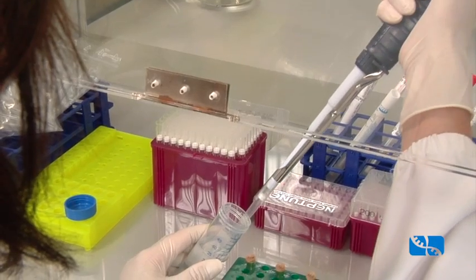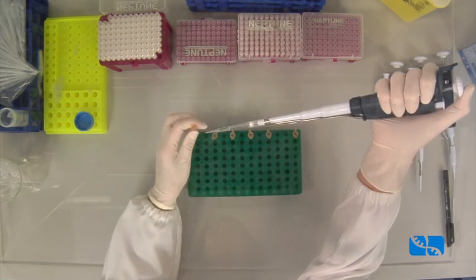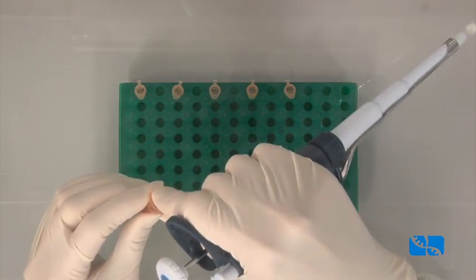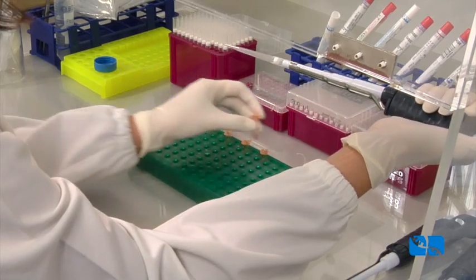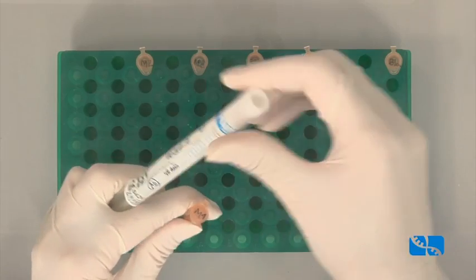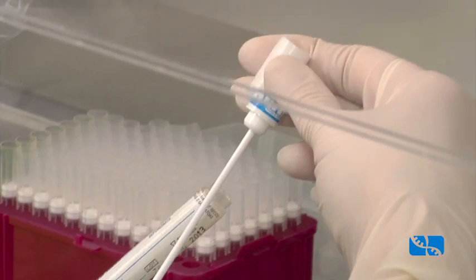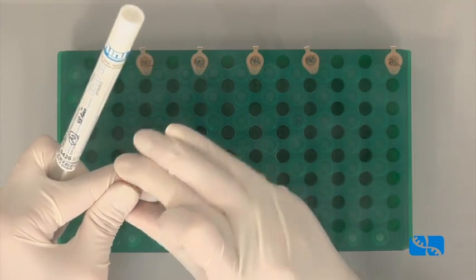Pipette 400 microliters of PBS in each Eppendorf tube carefully. It is important to manipulate Eppendorf tubes without touching the inside part of the cup. Take the swab carefully and introduce it inside its corresponding Eppendorf tube. Press the swab against the wall of the Eppendorf tube in order to allow cells to detach from the swab. Take the swab out and close the Eppendorf tube.